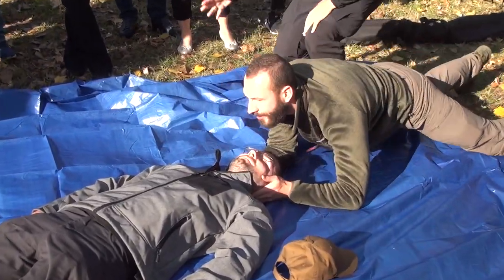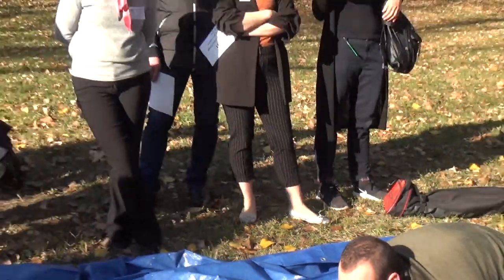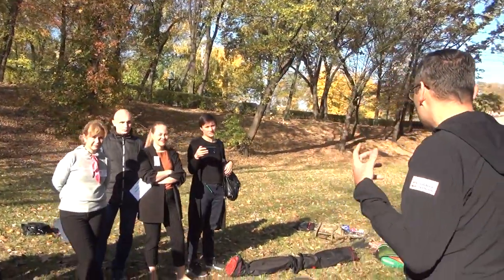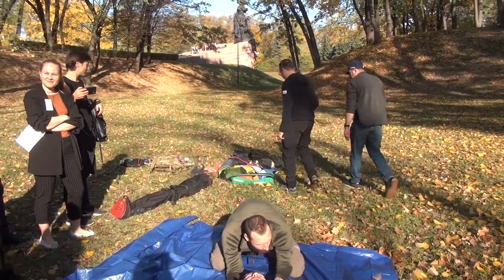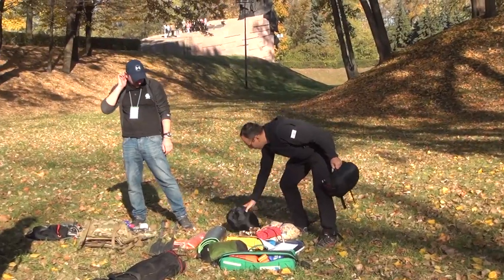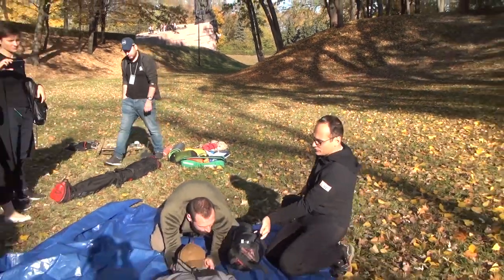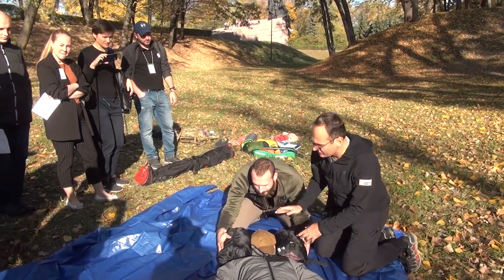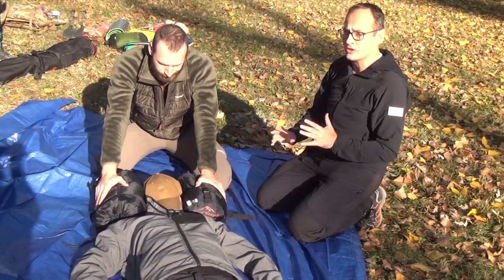Okay. So what would you use in the hospital to stabilize the C-spine? What can you use? Cervical collar. What else? Sometimes you have sandbags or something like that. Yes. But here we have... What do we have? Well, let's see. I've got some backpacks here. Let's, for example, use the backpacks to put next to the head. So something soft and bulky. It's easy, or at least something which makes sure that the head doesn't move around too much.